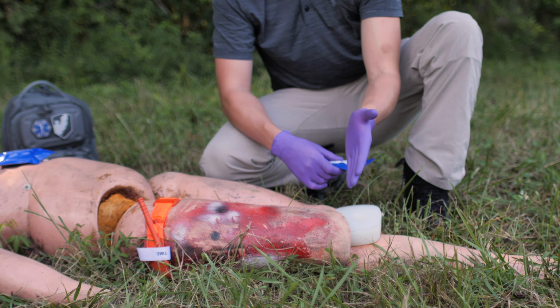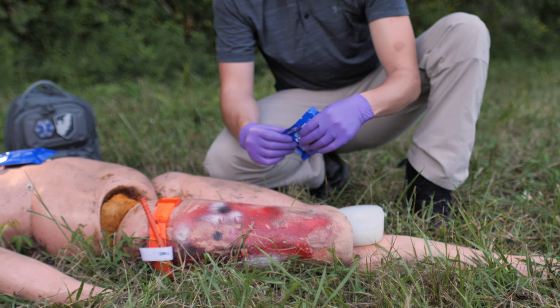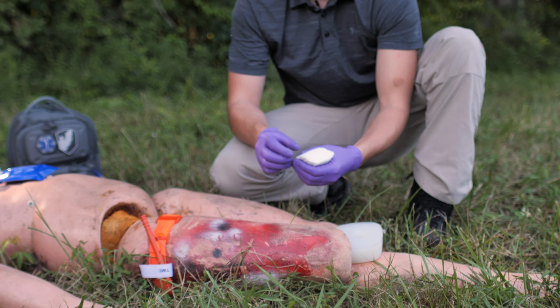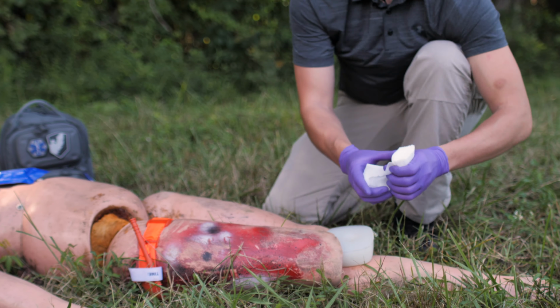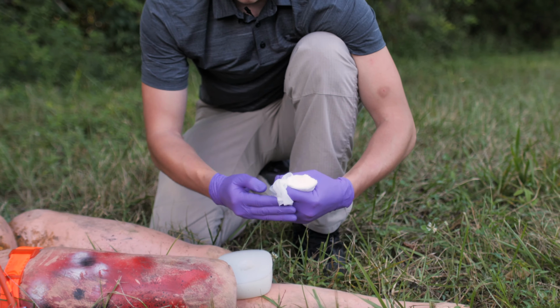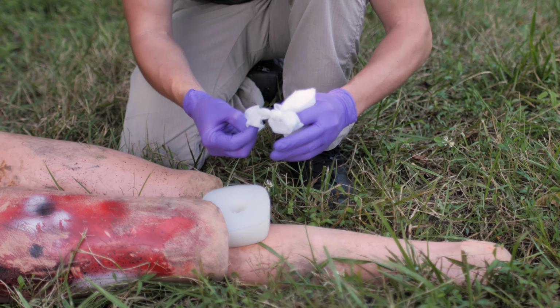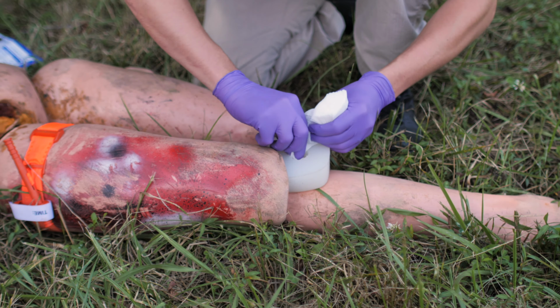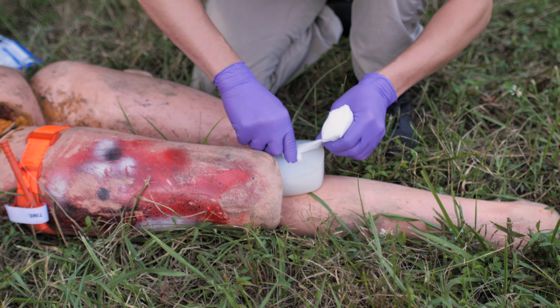We see the site of the bleeding. So we're gonna take our quick clot here. We're gonna pull this out and we're gonna start packing this in here. So I'm going to start with a little bit of a ball here for some bulk at the end. I'm going to find where the bleeding is. I'm gonna push that in there.